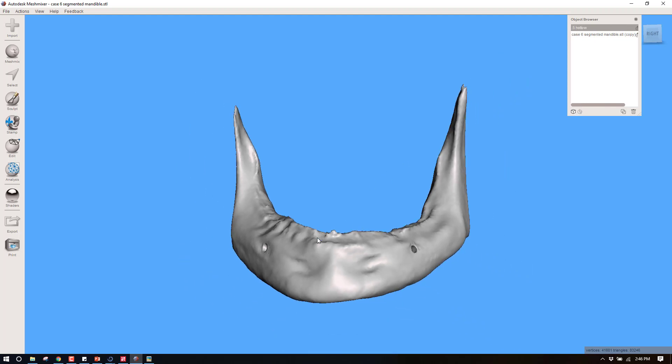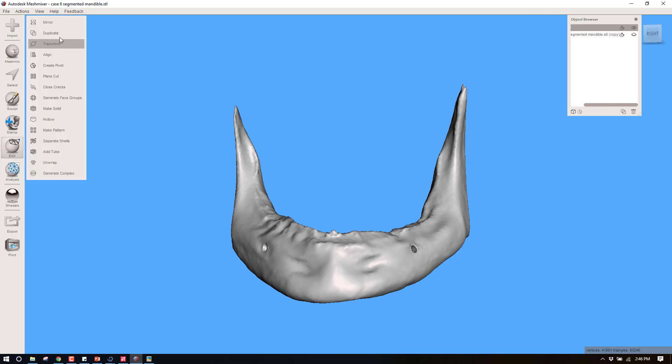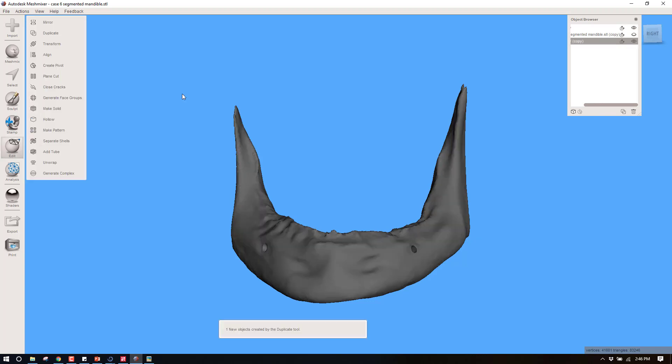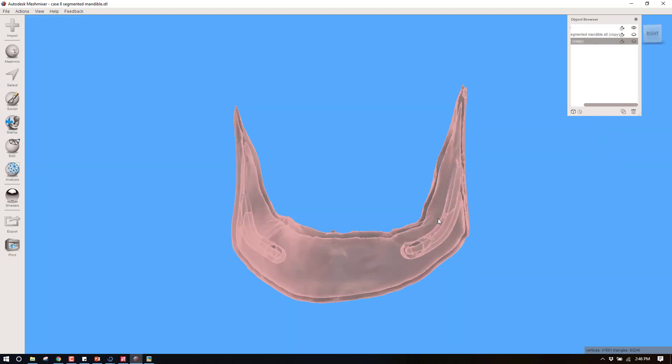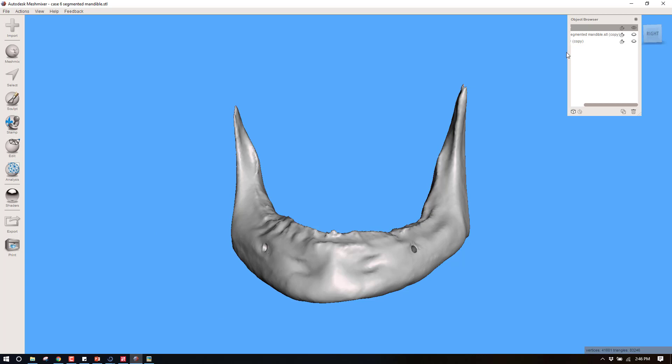Once again I'm going to duplicate this, this time the hollow one. So Edit, Duplicate. Now I've got two of those. Let's hide one of those and go back again to this one. Now I need to go about making the cancellous interior.